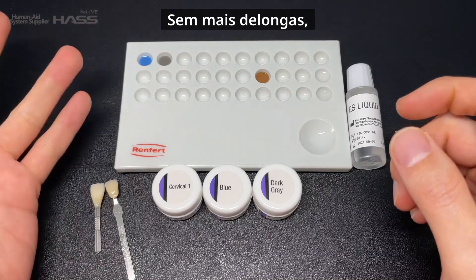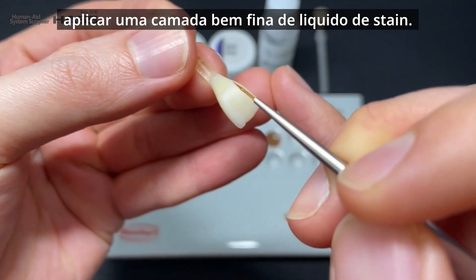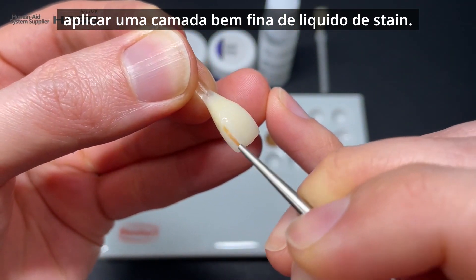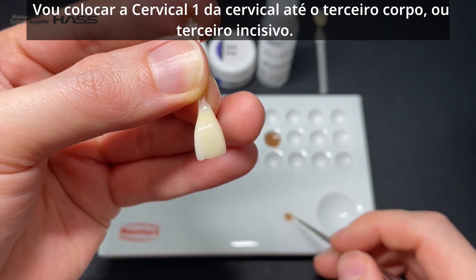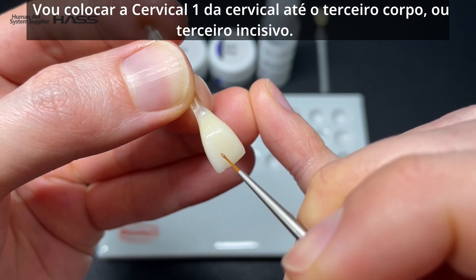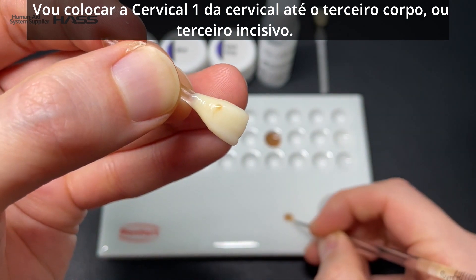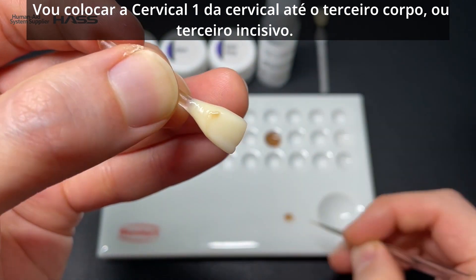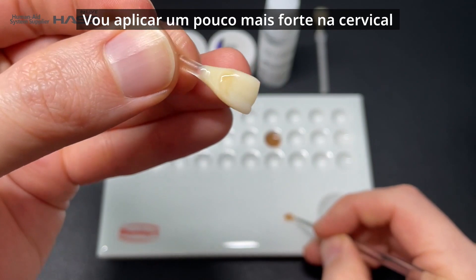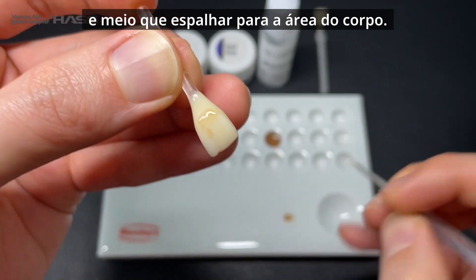Okay, so without any further ado, let's start staining. The very first thing I'm going to do is apply a very thin layer of stain liquid. I'm going to apply cervical one from the cervical to the body third or incisor third, applying a little more strongly on the cervical and kind of spraying it out toward the body area.